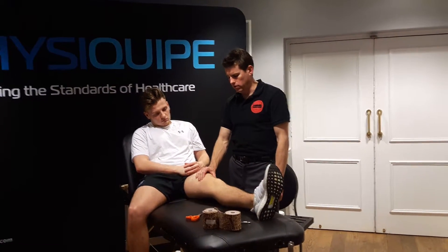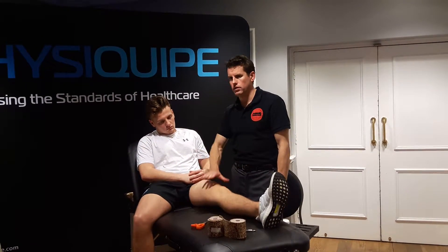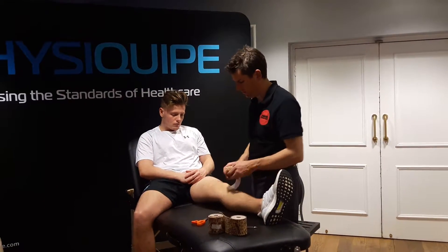Got a central quad tear here. What do I want to do? I want to unload the extensor mechanism. So here's what I'm going to do.